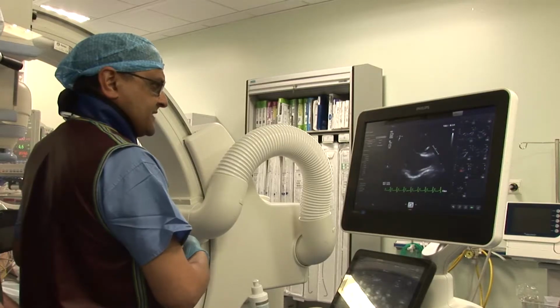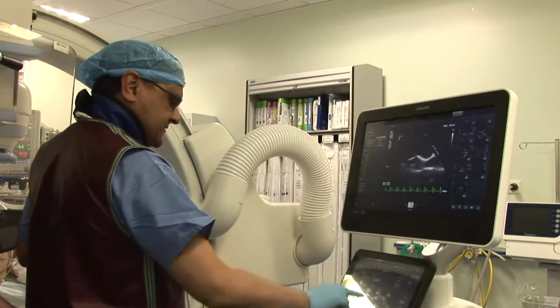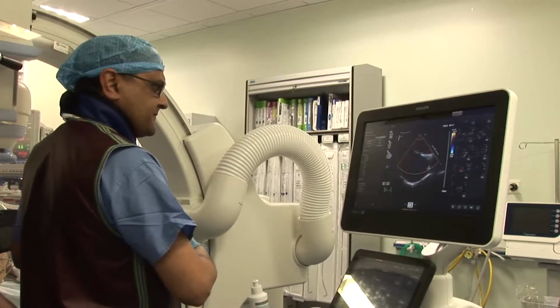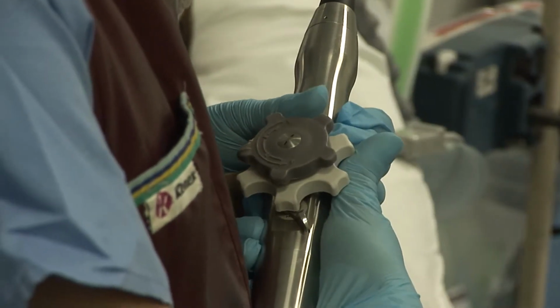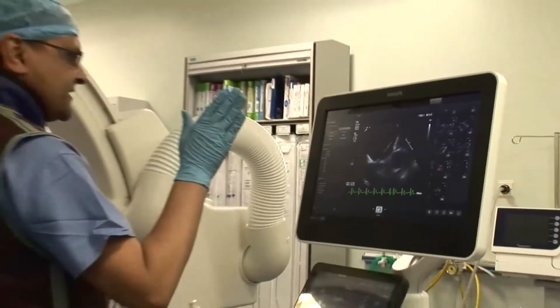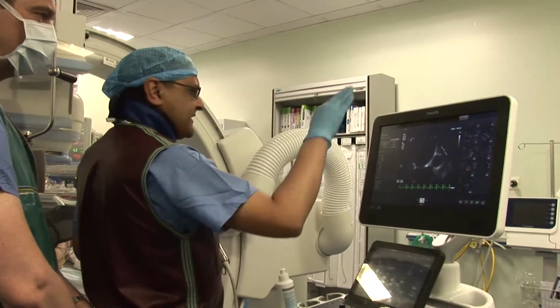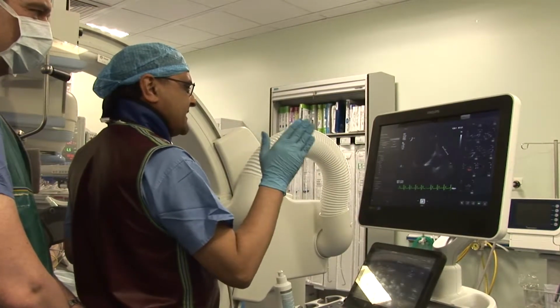So I can see your catheter through this PFO tunnel here. I'll stick the colour on. What I look at is if there's a PFO flap or tunnel, then even if there's some flow across it through that tunnel, I will call that a PFO.